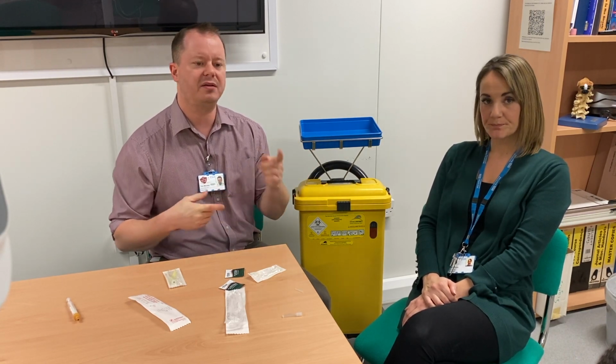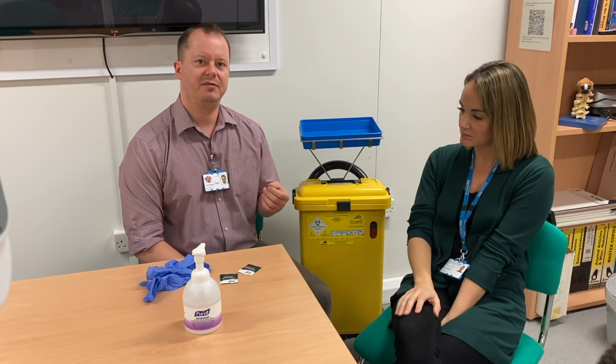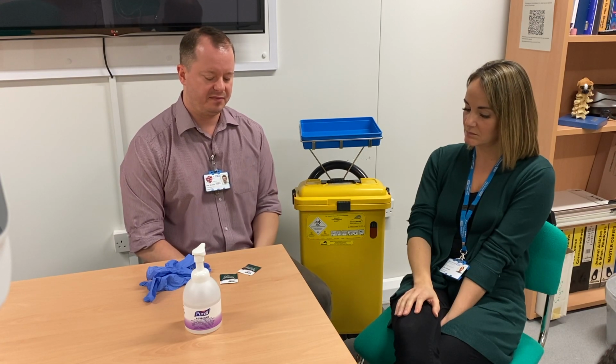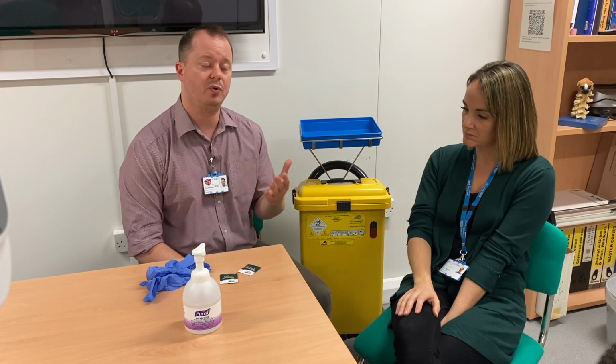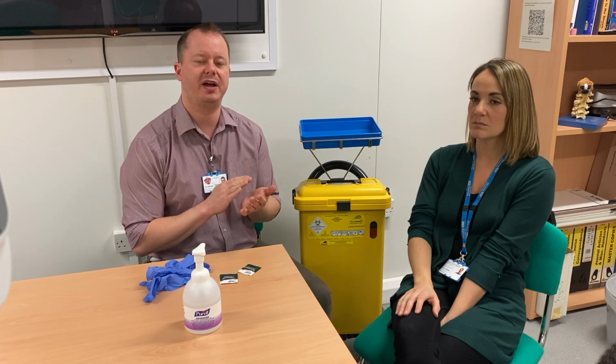Okay. And then next we're going to talk about infection prevention. So the final safety concern that we really want to talk about is infection prevention. This is a procedure where there is the chance of causing an infection. So for this procedure, the rule is that you must wear gloves.